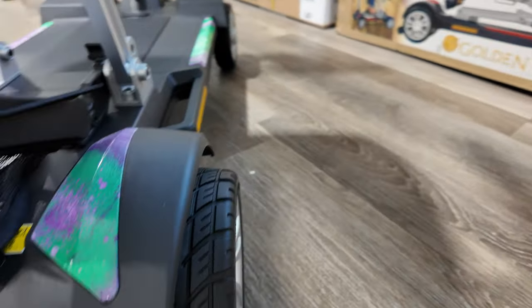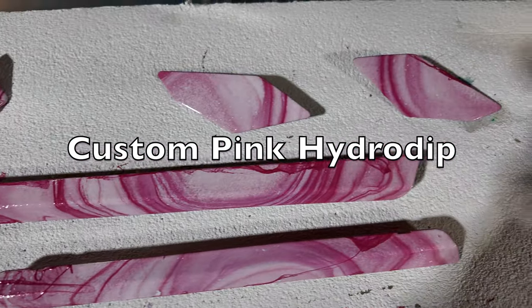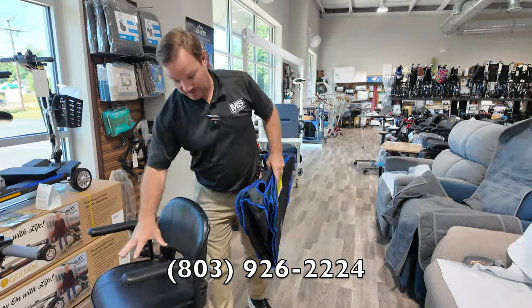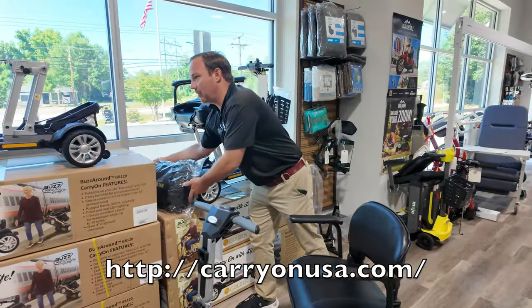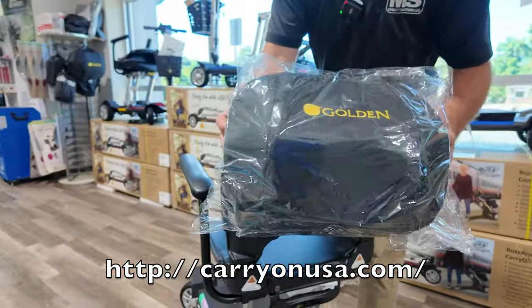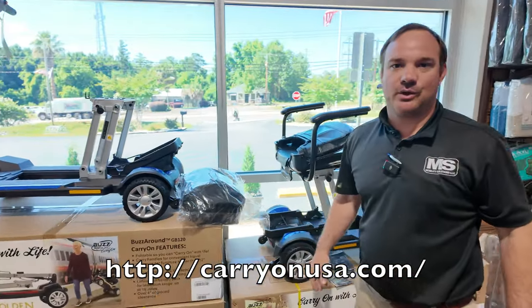So we're going to get this packaged up and shipped right out to her. This is the travel bag — it fully encloses the scooter. You'll also get a bag that will fully enclose the seat, or you can opt for our hard shell bag that goes on the back of the unit. So either this as a free gift or the travel bag. Only at CarryOnUSA.com.